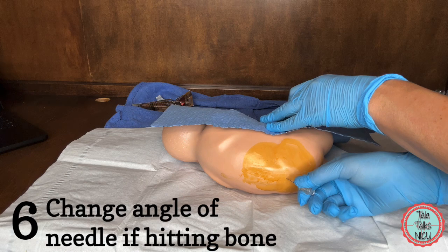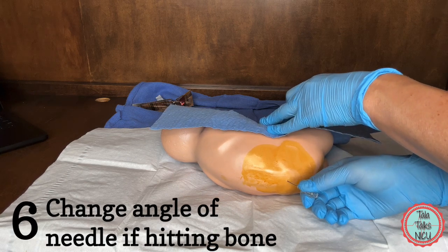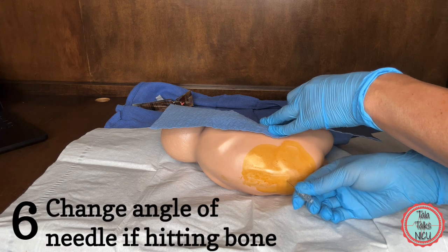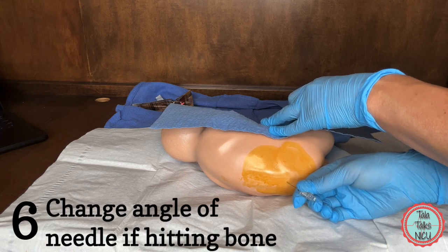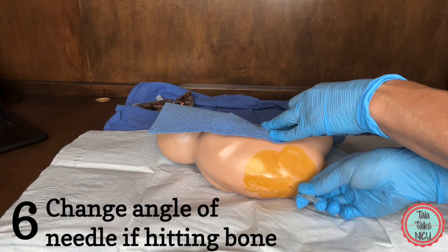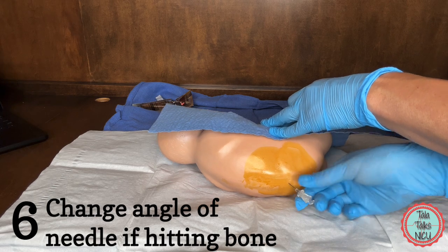Six: you're hitting bone. Most likely you're hitting the superior aspect of the spinous process. Take your needle out a little bit and then readjust it at a more upright angle. So instead of going in at a shallow angle, you turn it around a little bit more and put it at a larger angle.